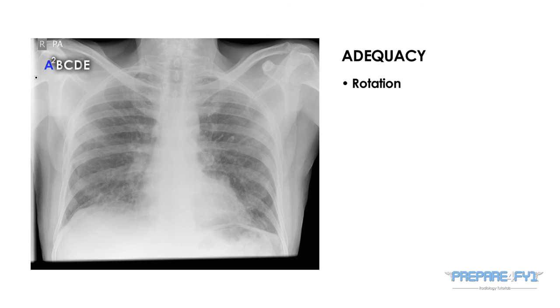First of all we will consider rotation. Look to see if the clavicles are symmetrical around the sternum. This will demonstrate whether the patient was appropriately positioned for the x-ray.